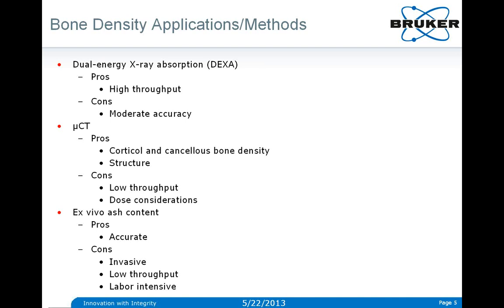And we also obtain in this kind of imaging, depending on the resolution, we might be able to make supplementary analysis of bone structure, not necessarily just bone density, but which may be valuable to the experimental analysis. The drawbacks for micro-CT: relatively low throughput, frequently one animal at a minimum 1 to 2 minutes, typically for an acquisition, and 1 to 2 minutes or longer for reconstructions, and maybe even longer for performing analysis.